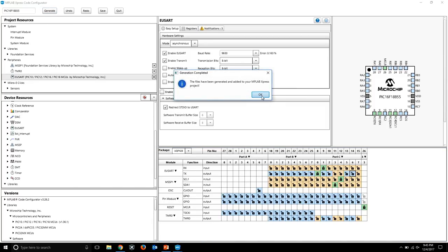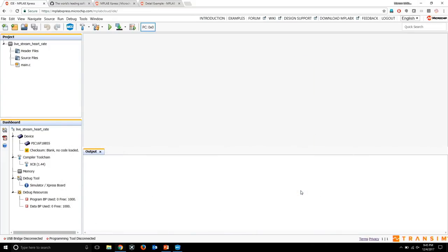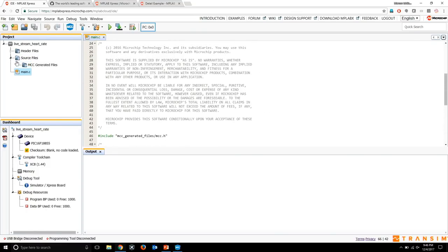All right. And it says it has been successfully generated. Wow, that's pretty fast. Yes. Now I'm just going to minimize this and go back to my IDE. Hit OK here. And you can see to the left right away, we have main.c that has been created for us. And other than main.c, we also have all the source code and all the header files. They're all created for us.